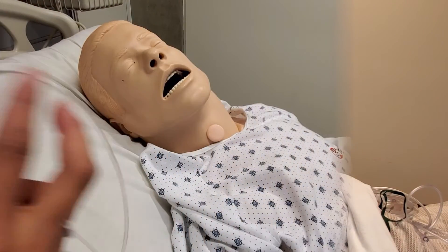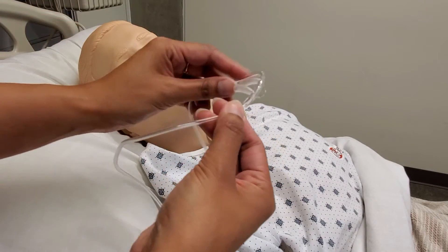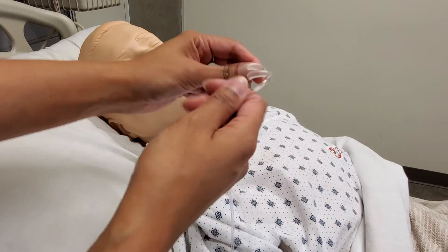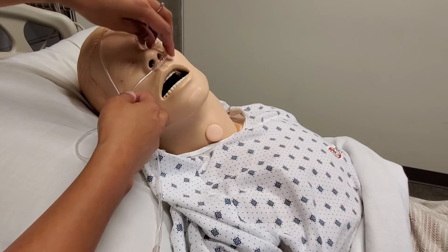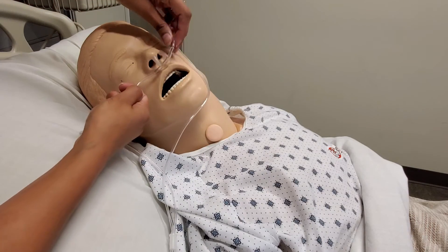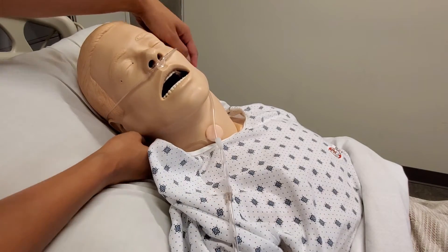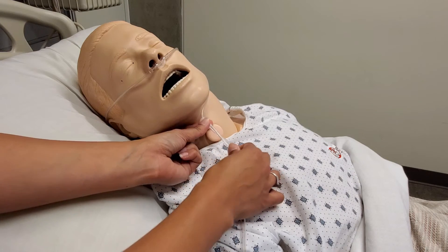To put on nasal prongs, make sure the prongs are facing downward and insert one in each nostril. Loop the tubing around the ears and tighten it right under the chin.